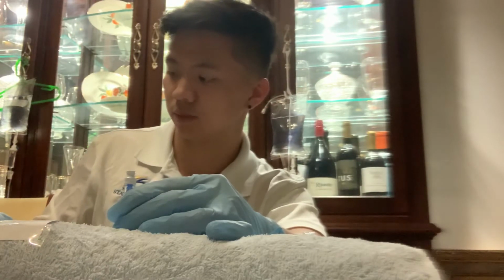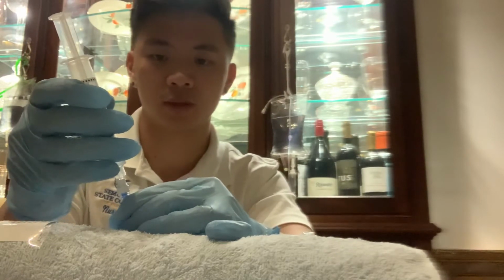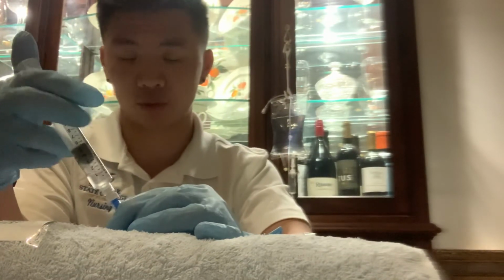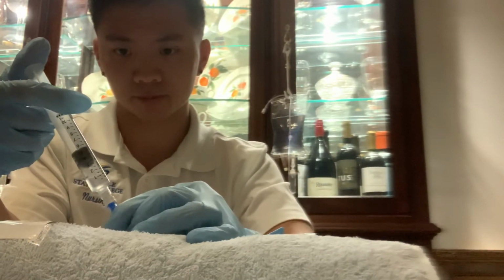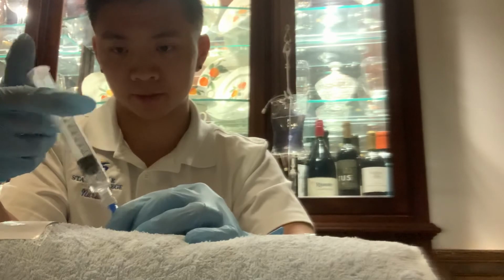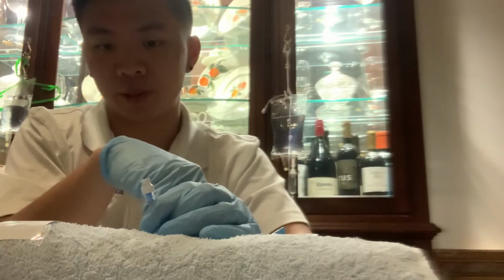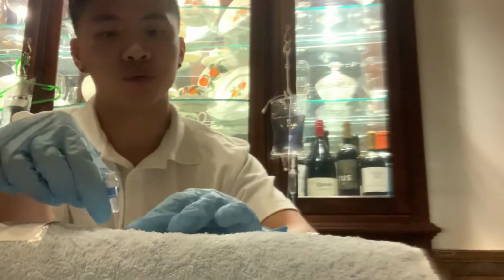And then I would insert my saline flush. And then I'm just going to slowly inject 3 milliliters of saline. So once I've administered 3 milliliters of saline, I'm going to go ahead and remove it. And then I would be all finished and close the clamp on the saline lock and remove it.